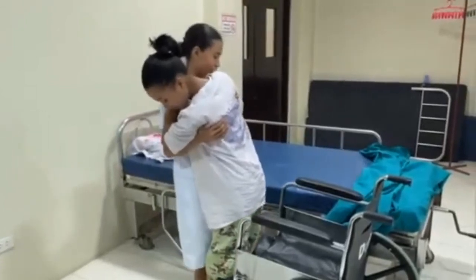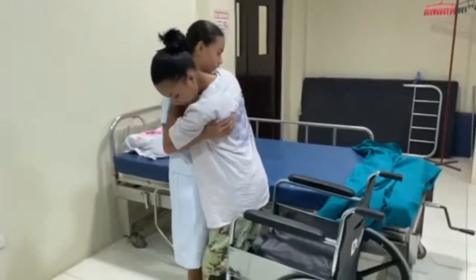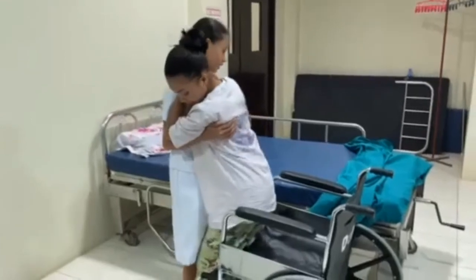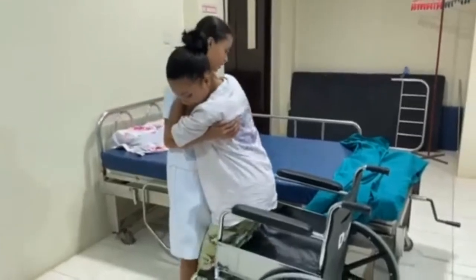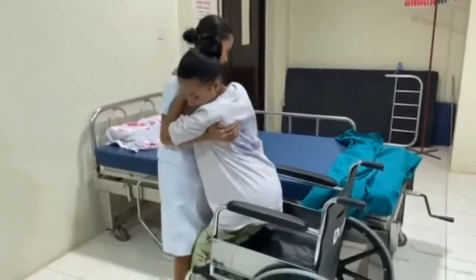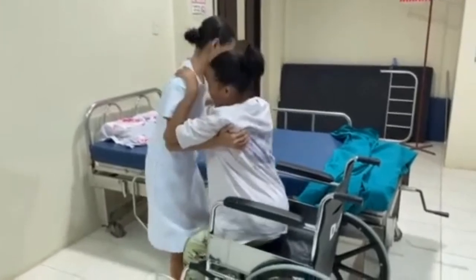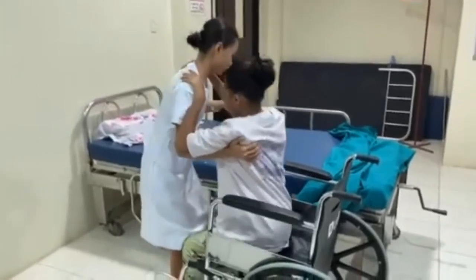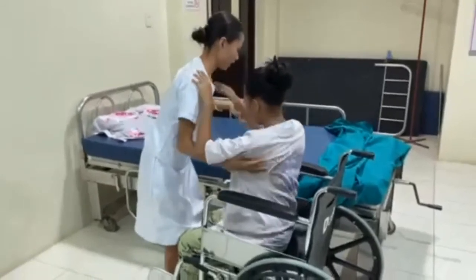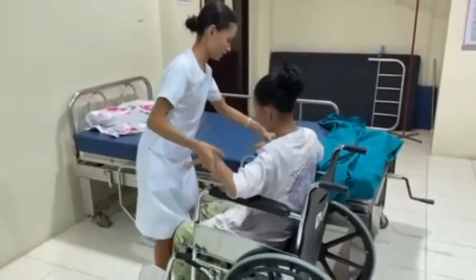Stand directly in front of the client. Place one foot forward and one back. Tighten your grasp on the transfer belt and tighten your gluteal, abdominal, leg and arm muscles. Have the client sit down while you bend your knees or hips and lower the client into the wheelchair seat. Step 7. Ensure the client's safety. Ask the client to push back into the wheelchair seat.